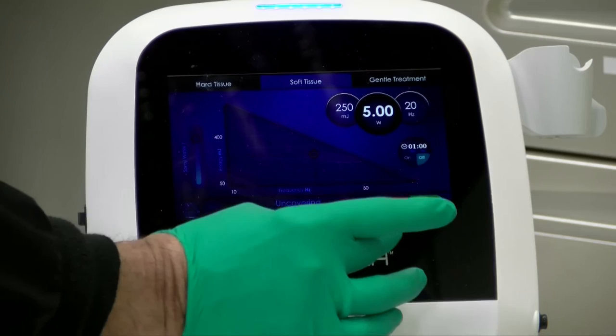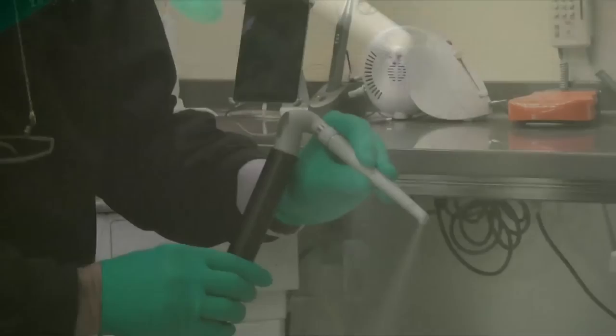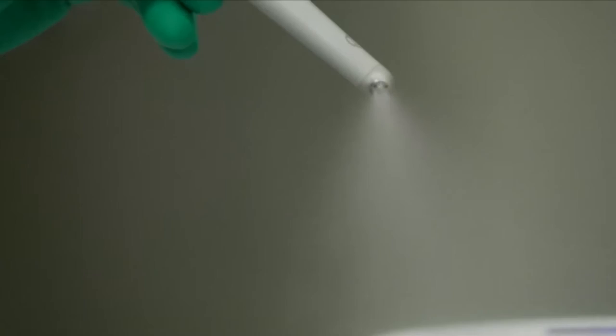I'm going to let you see the water flow — you can kind of see that, you hear the noise, and the light is actually on all the time. You will see occasionally a flicker, but look how that water flows.